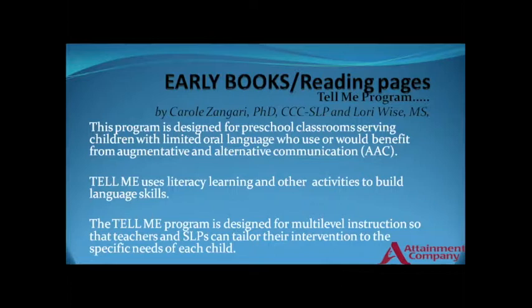So this program uses regular books that you would be reading to your kids anyway, and it has a bunch of different multi-level instructions on it. So what we developed with them were pages that go with each book, so that they have core language on them, plus the words from the book.